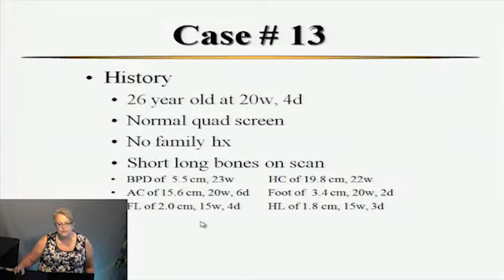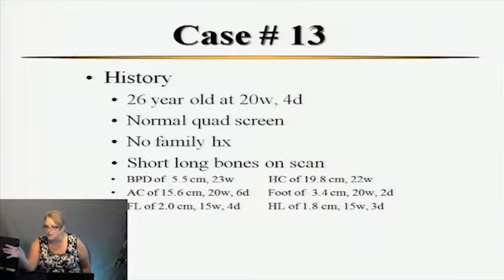Okay, so in your normal fetus, the femur and the foot should grow at the same rate from 14 weeks to 40 weeks. So you can actually measure the femur length divided by the foot length, and that should be normal if it's greater than 0.87. If it's less than 0.87, then it's abnormal.